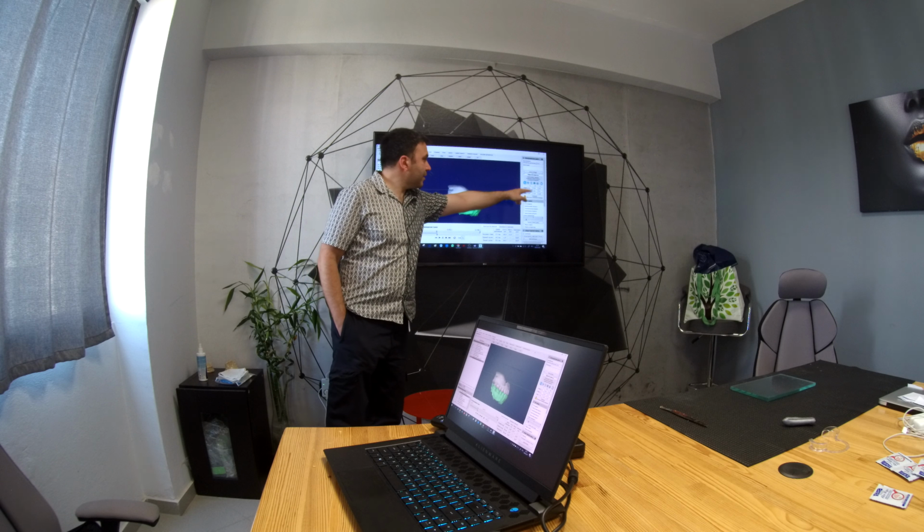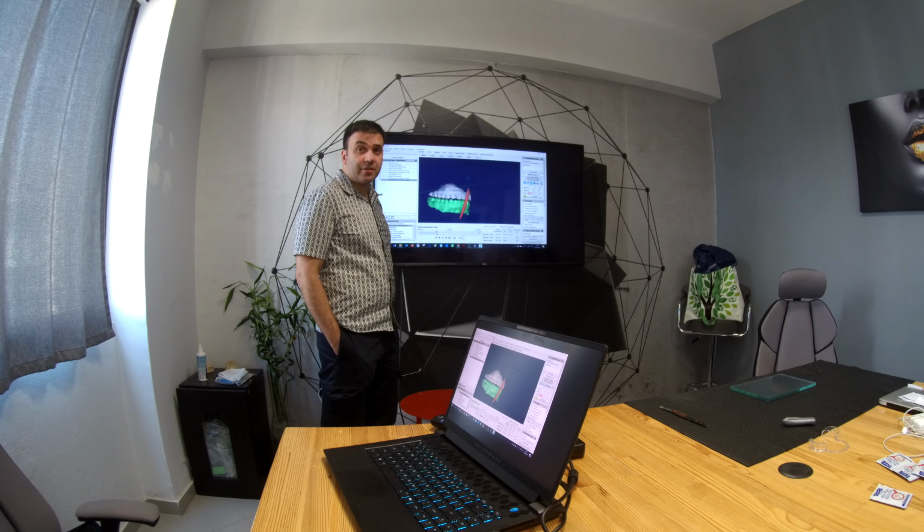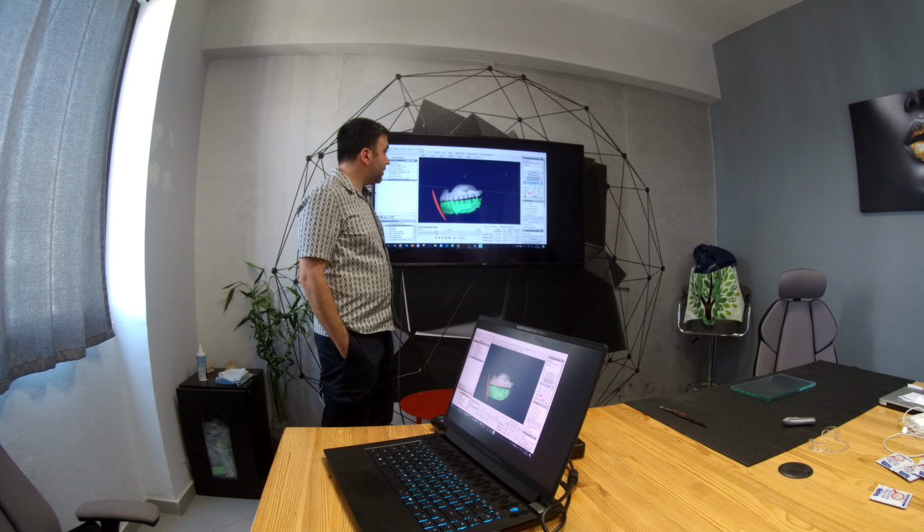This is the coordinates. So he opens again for the acrylic thickness, no more. Good. That's what he likes.